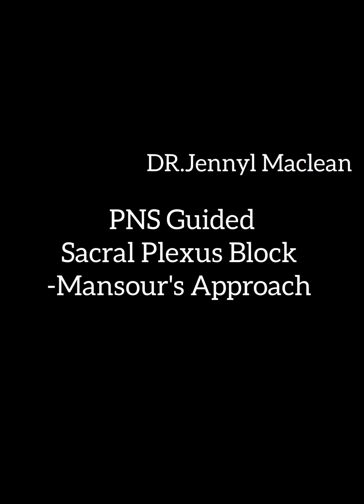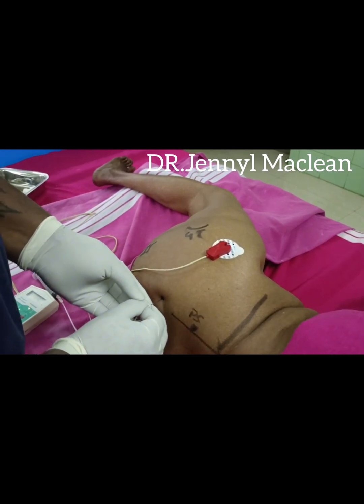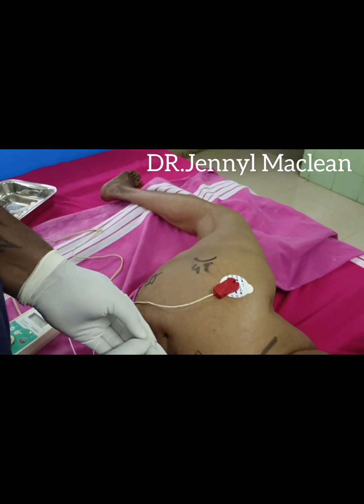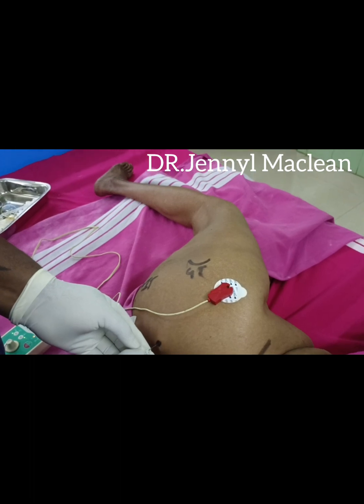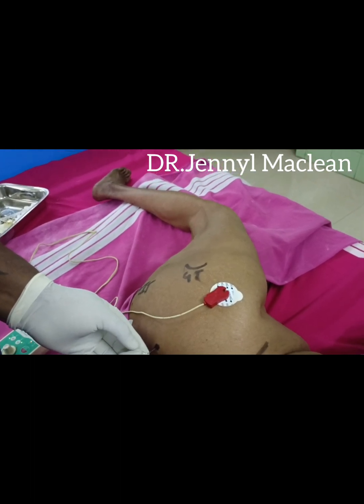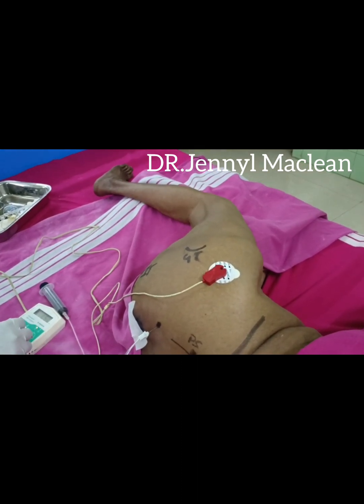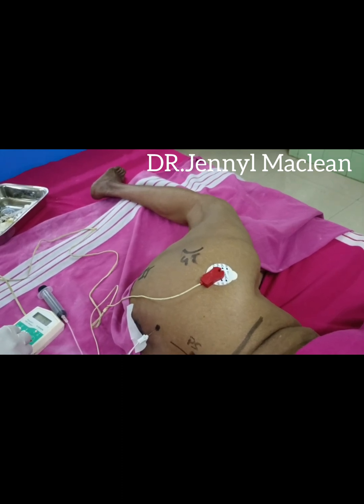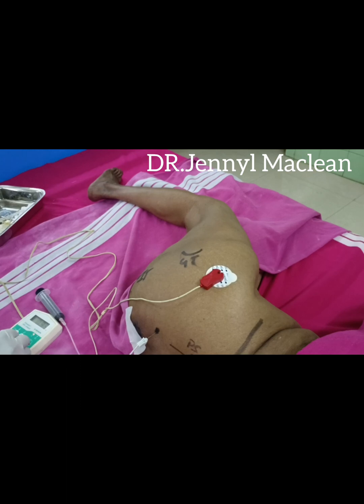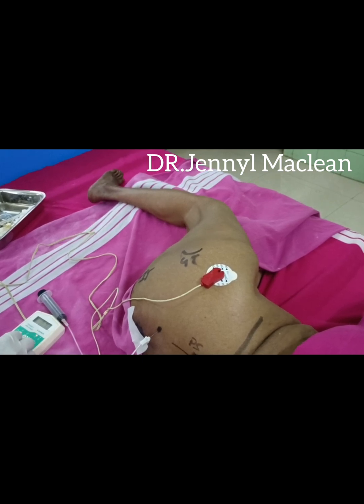Sacral plexus block, Mansour's approach. Posterior superior iliac spine, 6 cm below. Insert your needle. First you will elicit gluteus maximus contractions — that is by the inferior gluteal nerve — which means your needle direction is in the right plane. As you drive the needle 2 cm further, you will elicit plantar response or dorsiflexion.